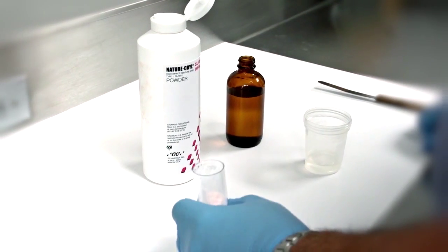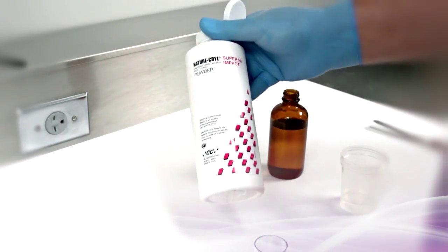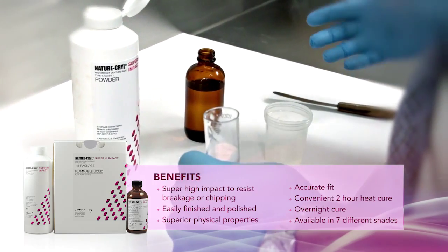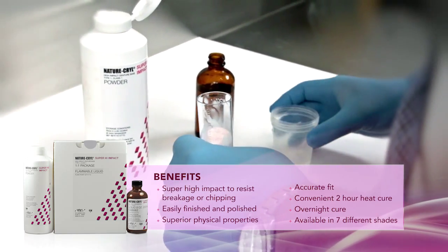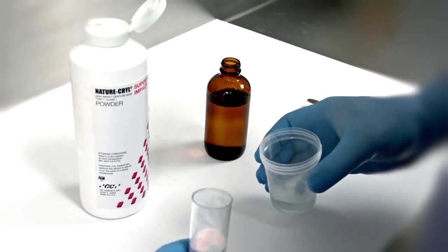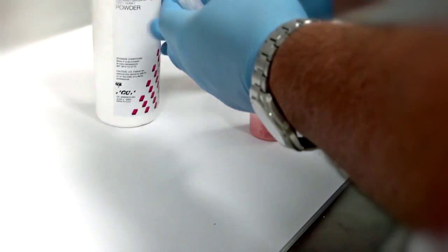Okay, we're going to pack our denture with Nature-Cryl's new super high impact material. It's the highest impact material on the market. And it's the standard mixture, 10 mLs of liquid to 30 of powder. So we have a big denture we're going to pack, so I'm going to put 2 units in. And always pour powder into liquid. That's 1.